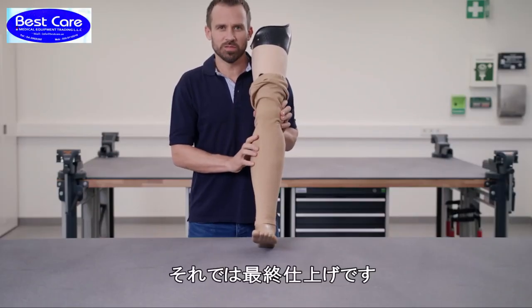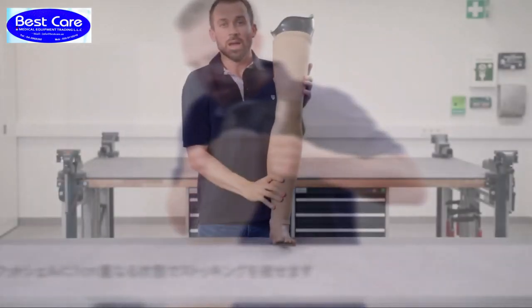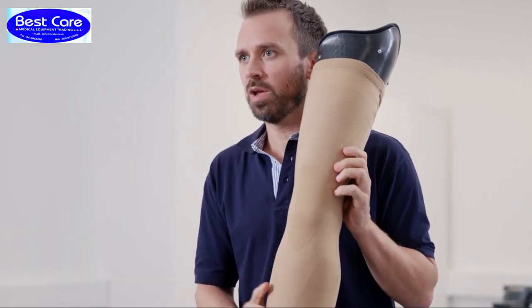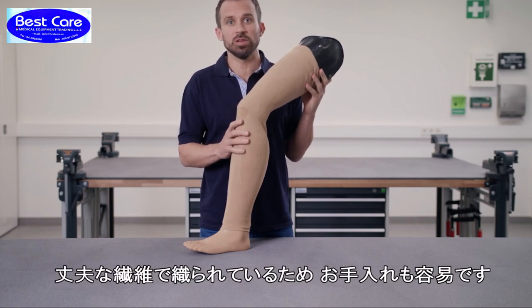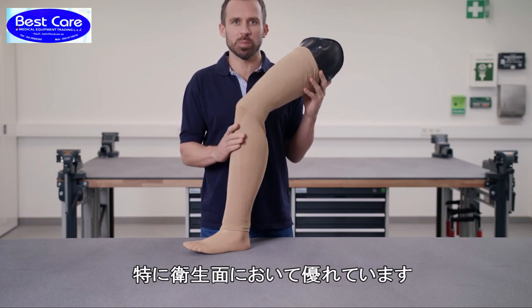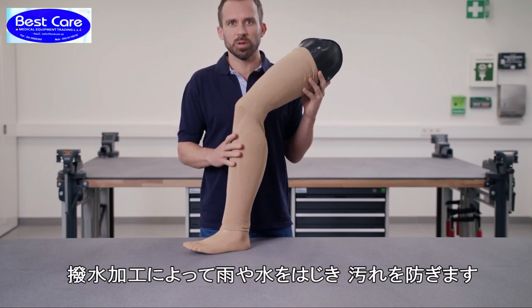Let's take a look at the functional external finish of the leg prosthesis. It's crucial that you make sure the functional stocking is properly positioned — only then will it offer its full range of functionality. It is made of durable threads that are also easy to clean. Its hygienic properties are notable: it is washable, resistant to dirt particles, and also repels spray water.